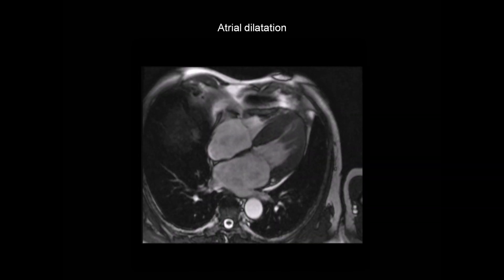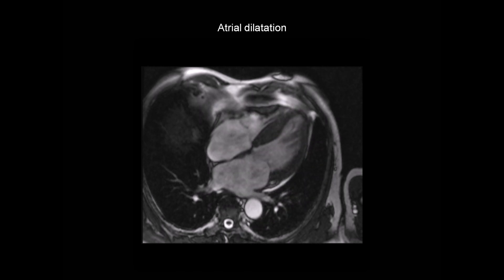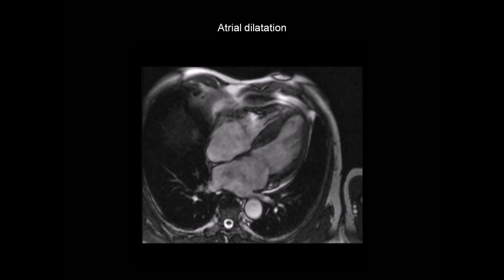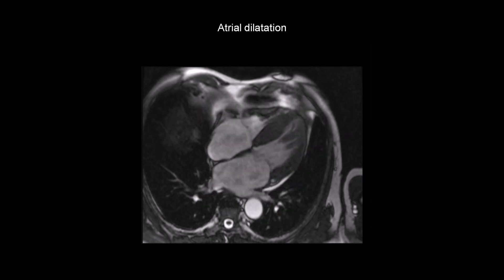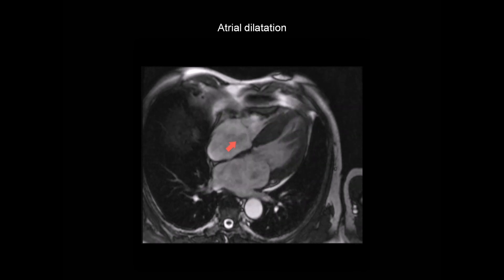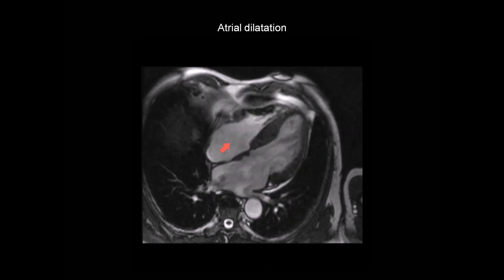A consequence of myocardial thickening is diastolic impairment and elevation of ventricular filling pressures, which increases the stretch on the atria. So in this patient with cardiac amyloidosis, we can see myocardial thickening, but also dilatation of the atria as a consequence of these raised filling pressures.